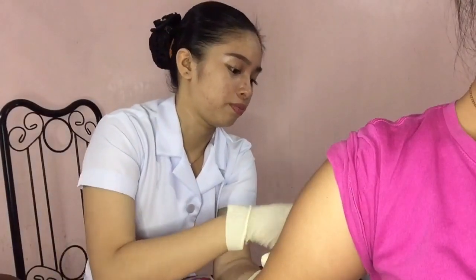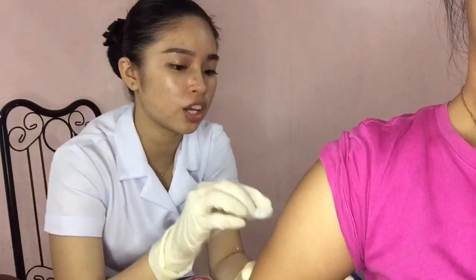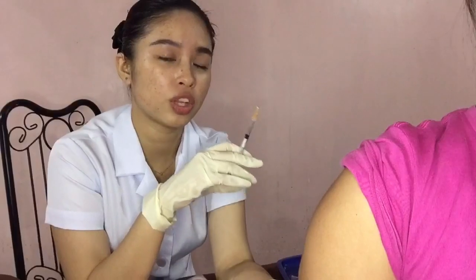Place the patient into a comfortable sitting position and ask the patient to relax the area that you are about to inject. So ma'am, just relax. Don't forget to apply clean gloves and clean the site with an antiseptic swab in a circular motion, starting from inner to outward. Now let's remove the needle cap by pulling it straight off. Hold the syringe with the thumb and forefinger of the dominant hand as if you are holding a dart.